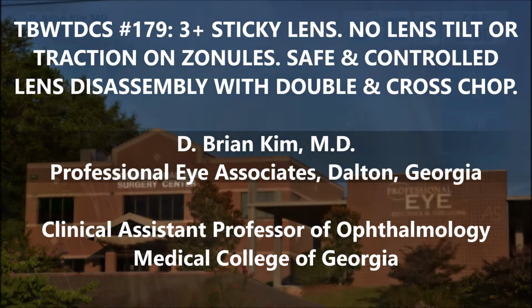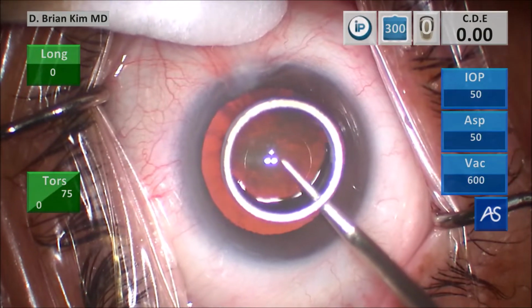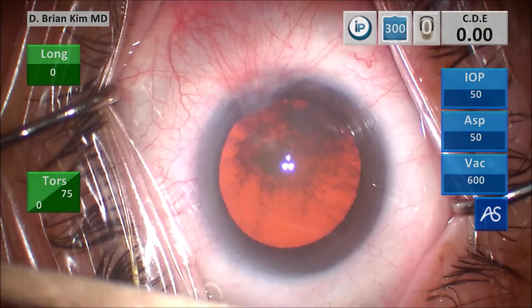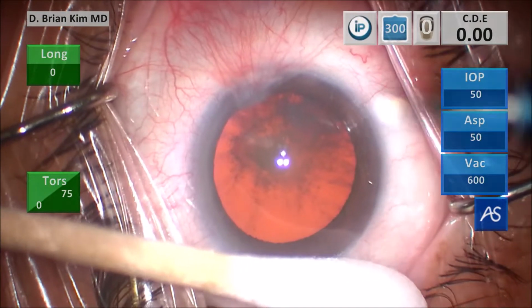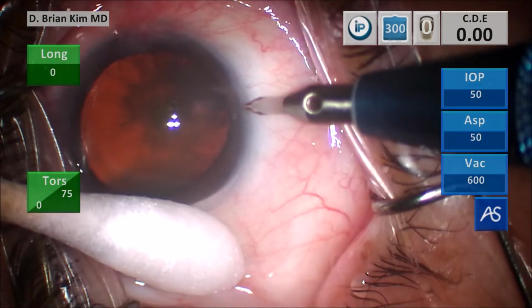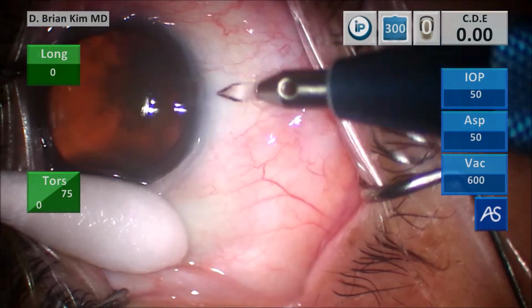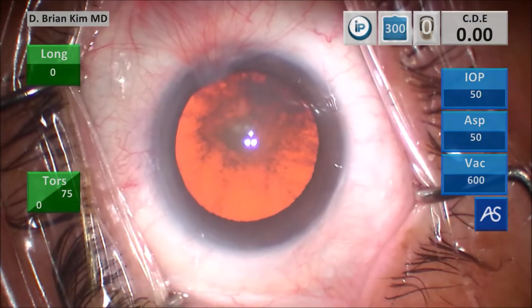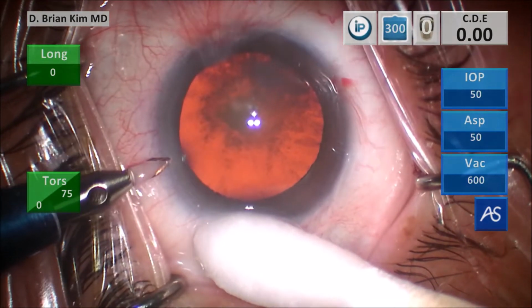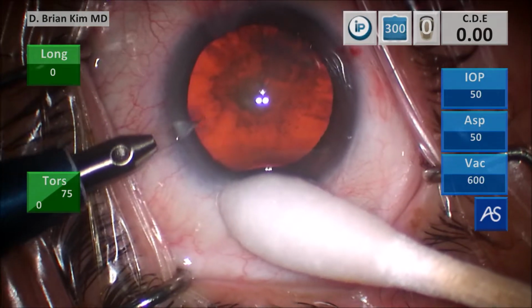forces. So use a cotton tip to steady the eye, and this is a corneal marker, which will help me to center and size the rexis. You can see there's a small pterygium nasally in this patient as well. Using the cotton tip to steady the eye, I turn the eye towards the left to make my paracentesis incision, first on the right side and then the left side, making sure I'm flat to the iris plane, which creates a nice corneal shelf, which will allow me to achieve a self-sealing incision.